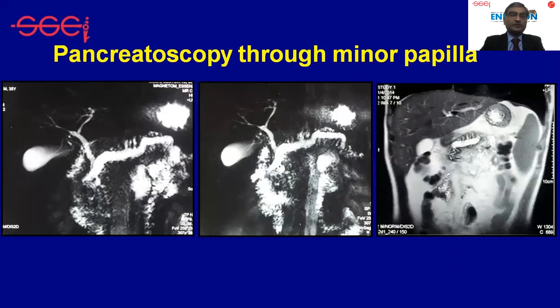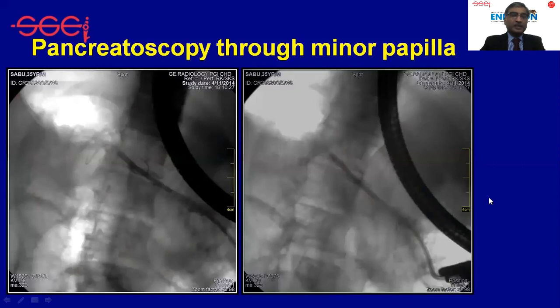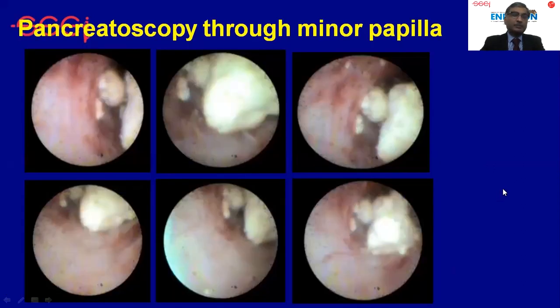This is a patient with pancreas divisum and chronic pancreatitis where we have used the SpyGlass to pass through the minor papilla. After passing the scope into the tail region, we can see multiple large stones which are white due to calcium deposition.